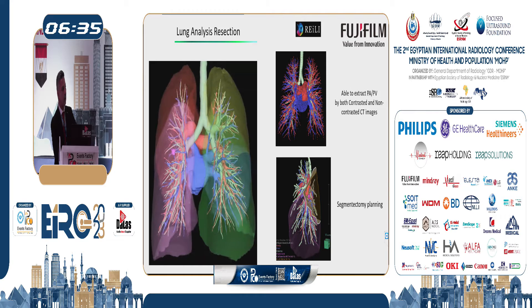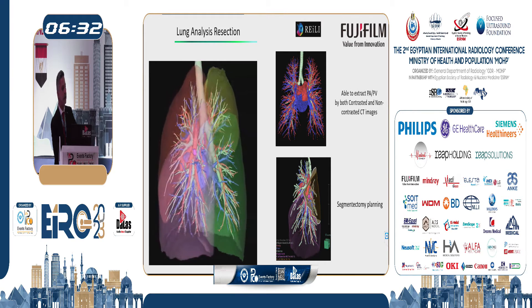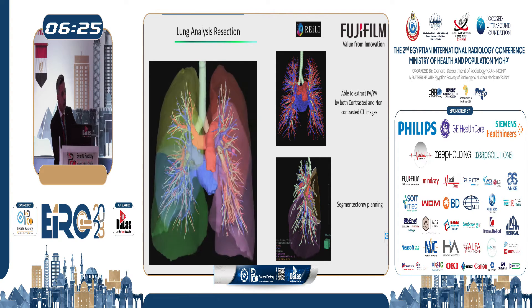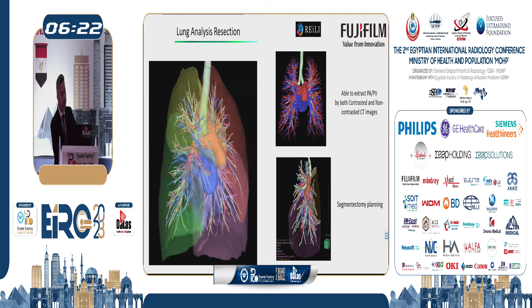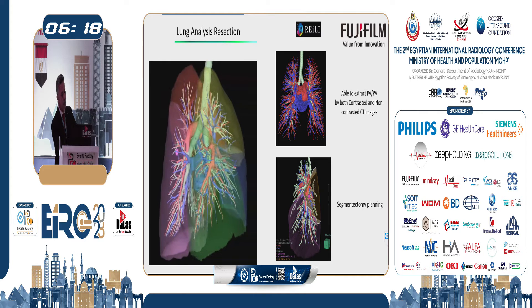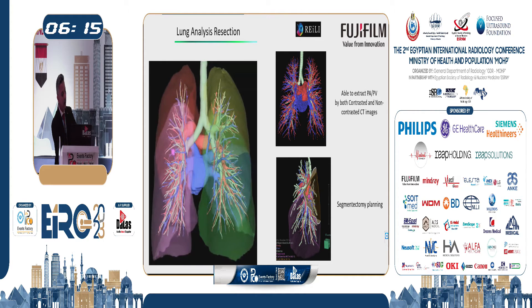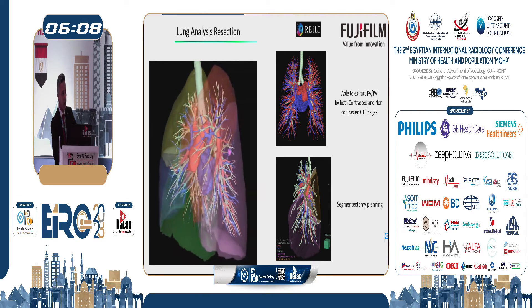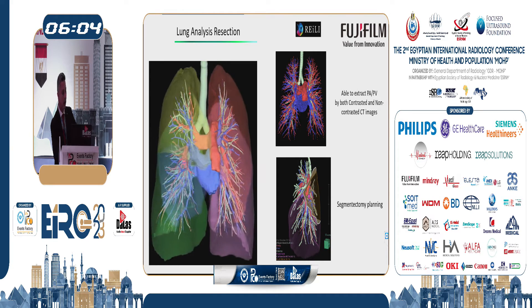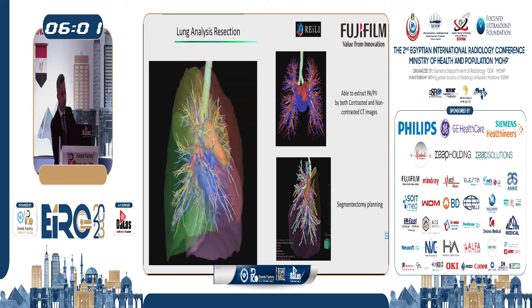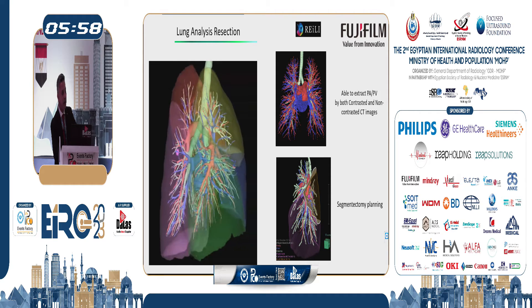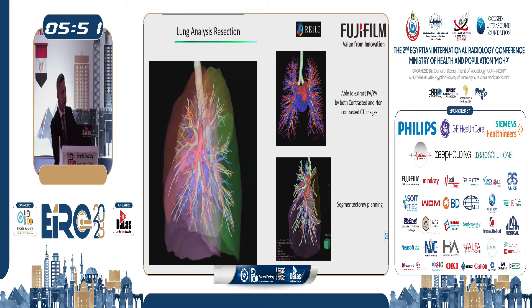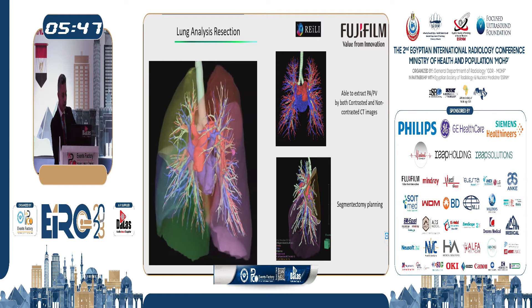Regarding lung cancer resection, Synapse 3D plays a very important role in specifying the nodule, cancer, or tumor within the lung — from its position, signal intensity, and its relation to internal structures. In the volume rendering, you can see a nodule with close relation to the pulmonary vein, pulmonary artery, trachea, and bronchioles. Additionally, Synapse 3D is able to simulate surgical planning by guiding bronchoscope insertion from the trachea, helping the surgeon find the best path to reach and resect the nodule.